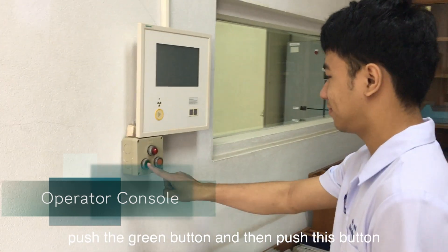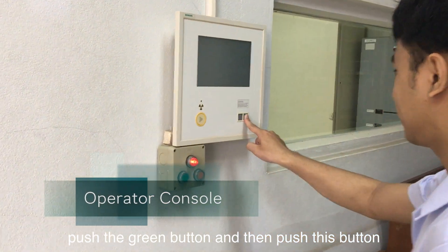First, turn on the machine. Push the green button and then push this button.